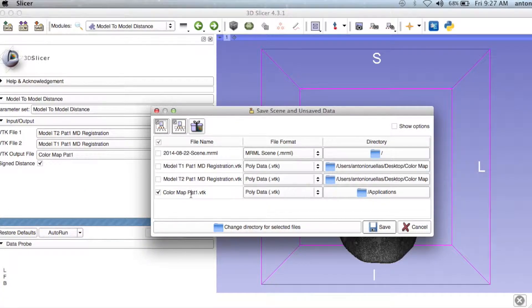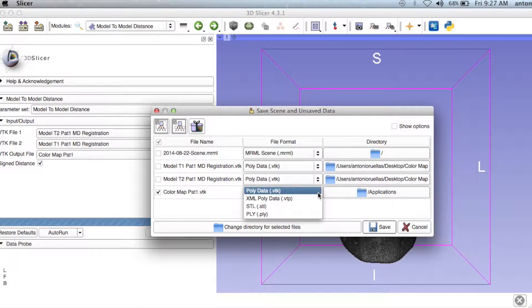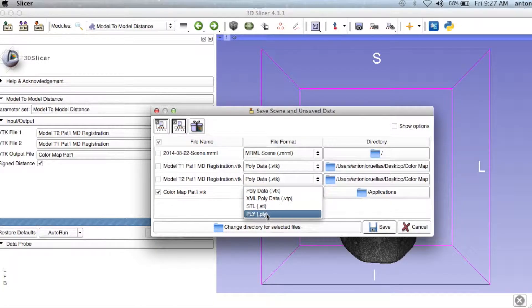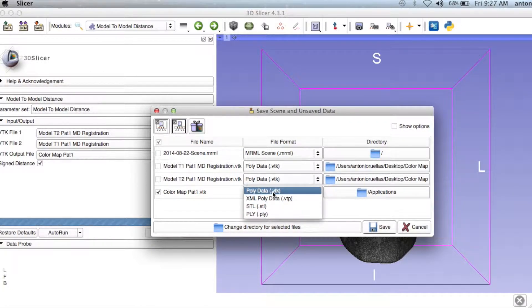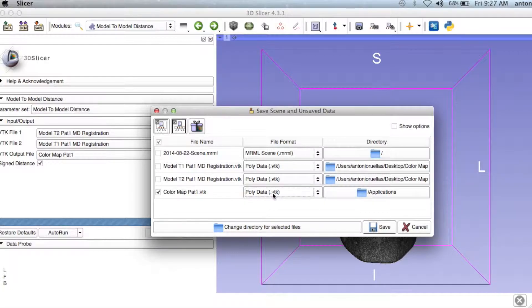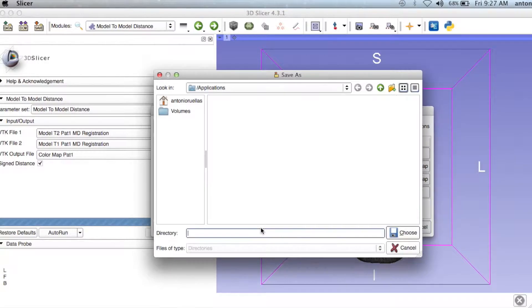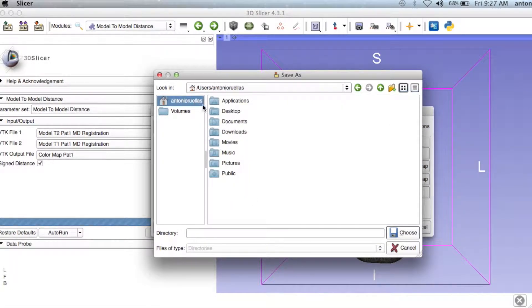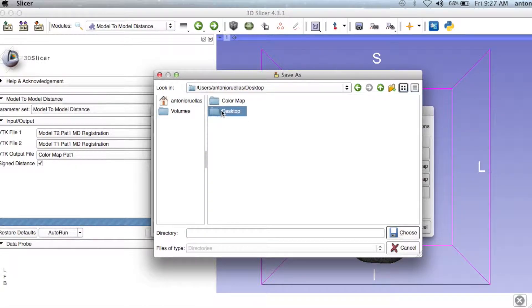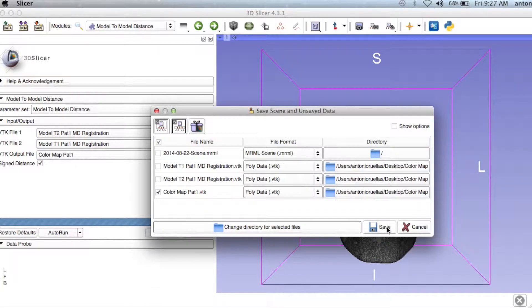You have the option to rename the file and change the file format, but keep the VTK file format for now. You can also change the directory here. Click Save.